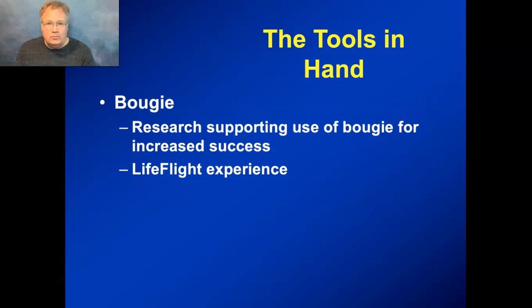So probably the most important tool, and it's being more and more recognized in emergency medicine, is the Bougie. Use of the Bougie every time, first pass, every time, increases success rates. That's been LifeFlight's experience, and there have been a number of articles published on that. So, Bougie every time.